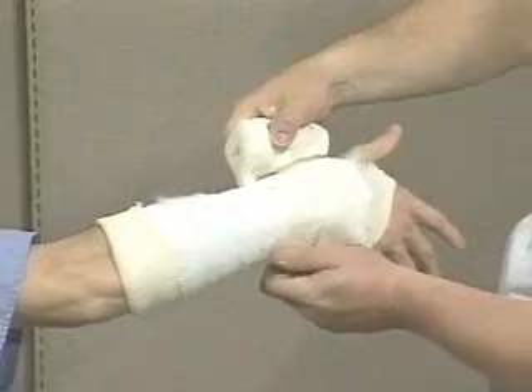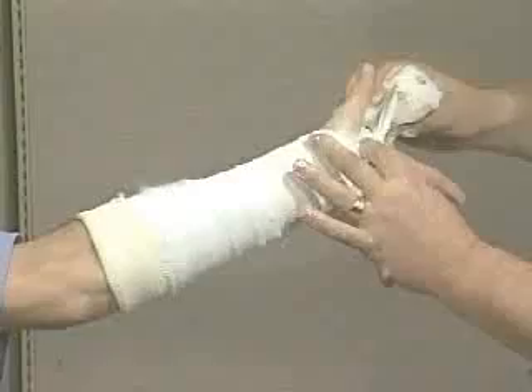Start the plaster wrap at the wrist, then wrap several times around the hand, pinching plaster through the first web space. Extend the cast proximally.